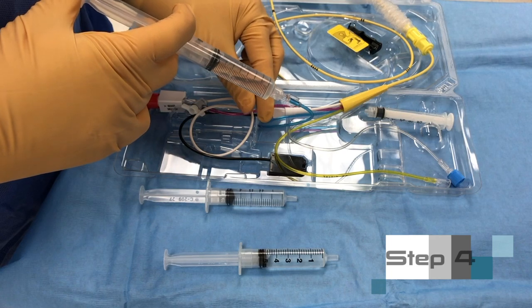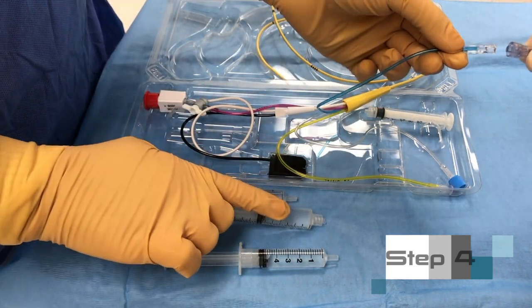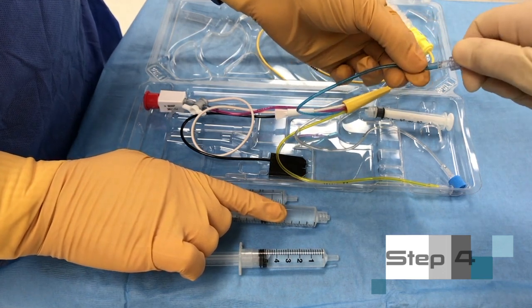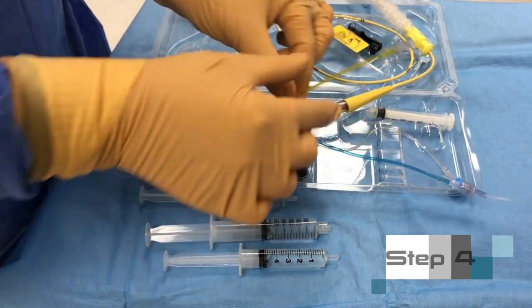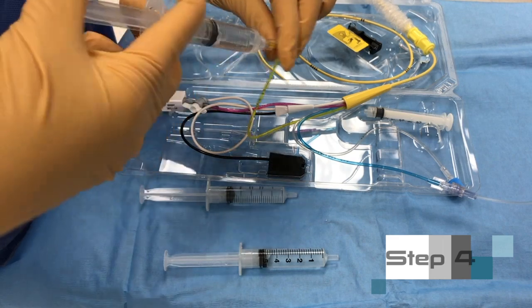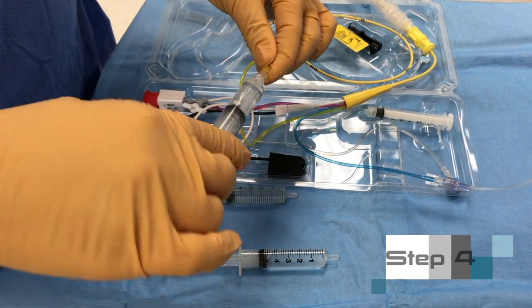Have the assistant connect the right atrium port to a CVP transducer. And connect the PA port to the pulmonary artery pressure transducer.